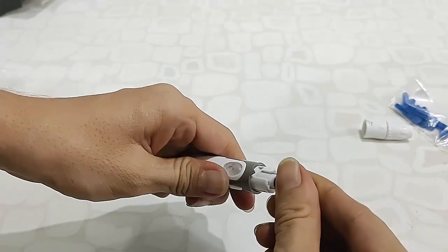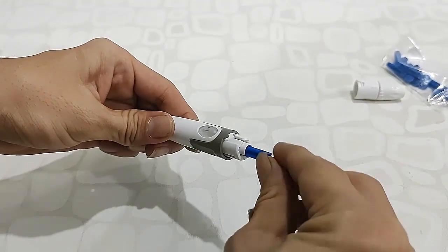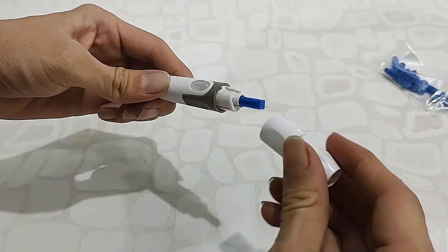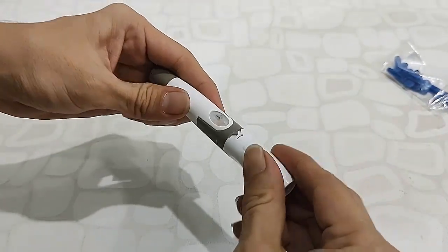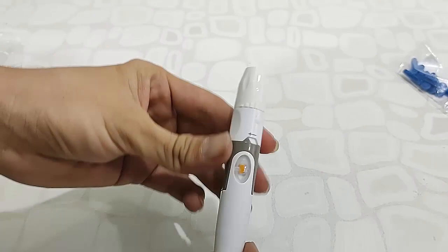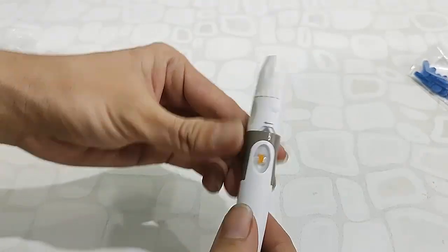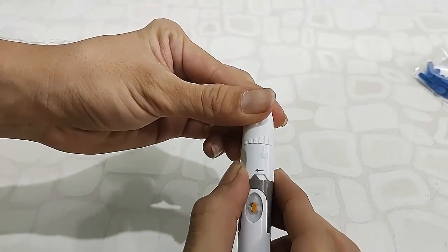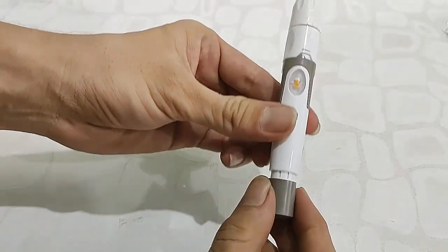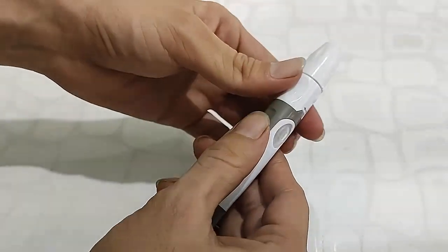Insert and push gently — you will hear a click sound. Then remove the upper cap and attach the lancing cap. After that, you can set the puncture depth pressure. Then press and release the bottom button, and your lancing device is ready to use.